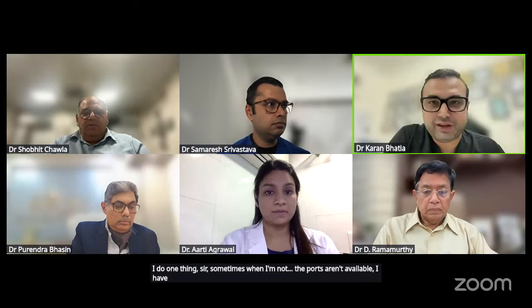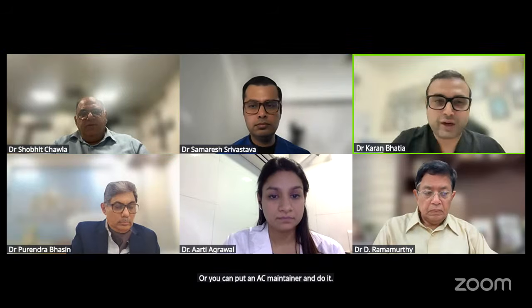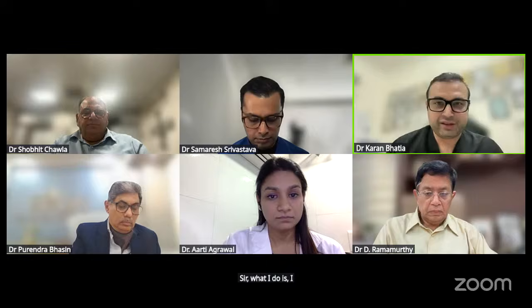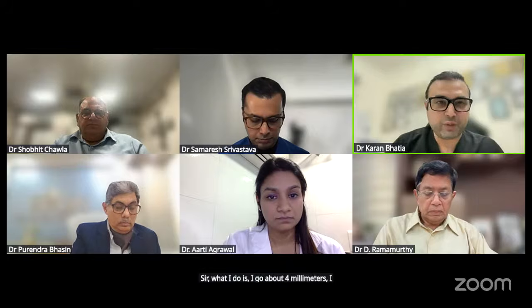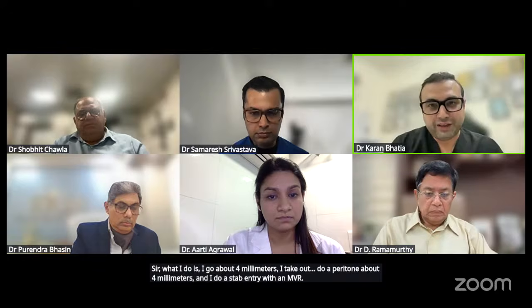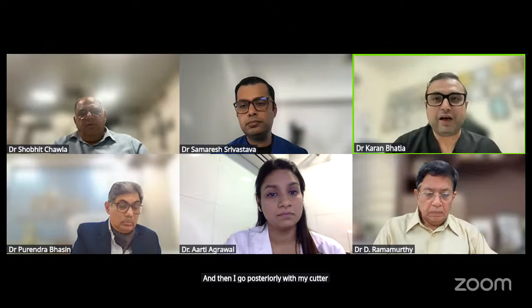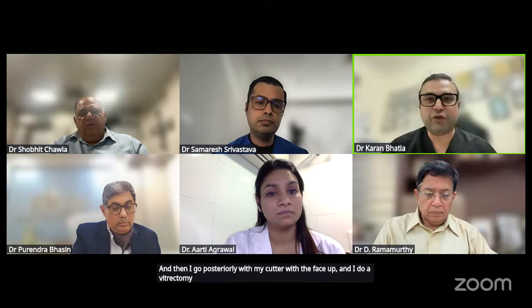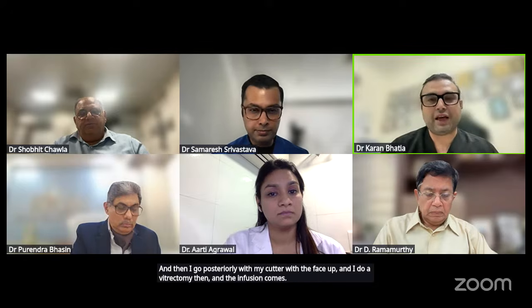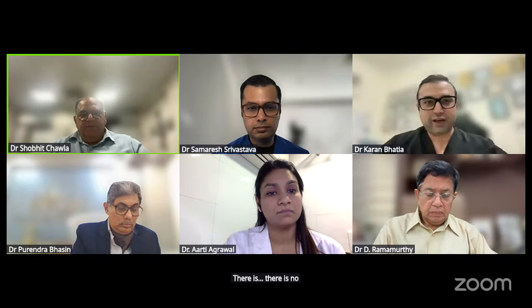I do one thing, sir. Sometimes the ports aren't available. I am an anterior segment surgeon and I don't have the vitrectomy machine. You can put an AC maintainer in. What I do is I go about 4 millimeters, do a peritomy, and do a stab entry with an MVR. Then I go posteriorly with my cutter with the face up, and I do a vitrectomy. The infusion comes through the cannula. There is no harm in that.